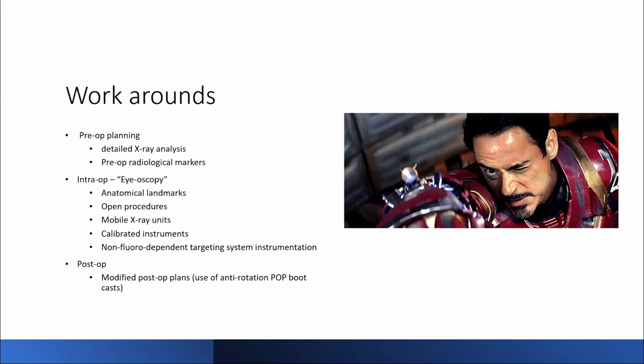Intraoperatively, I call this the ioscopy, where you kind of eyeball it essentially. Again, you are going to be relying on anatomical landmarks. You may need to rely on open procedures rather than choosing the minimal access route. There is also the use of mobile X-ray units for some procedures that absolutely require precision.